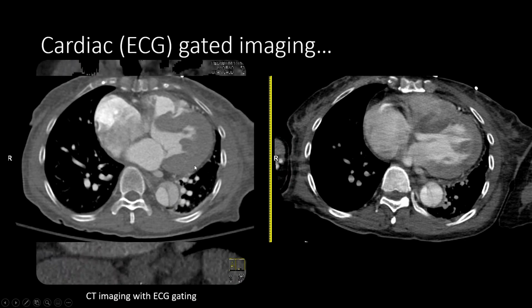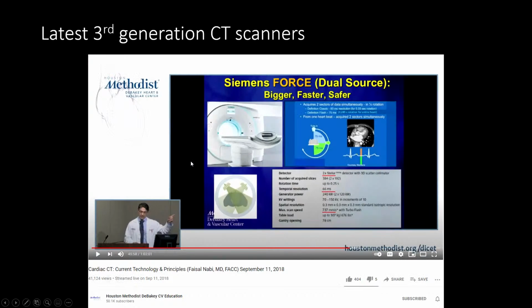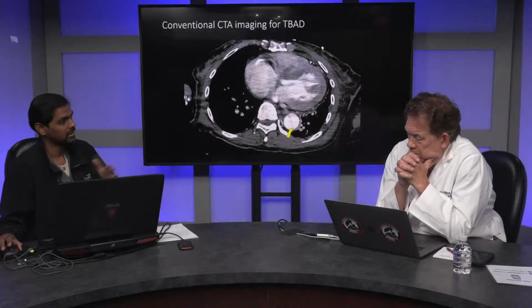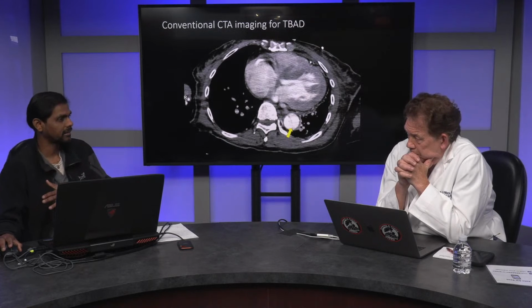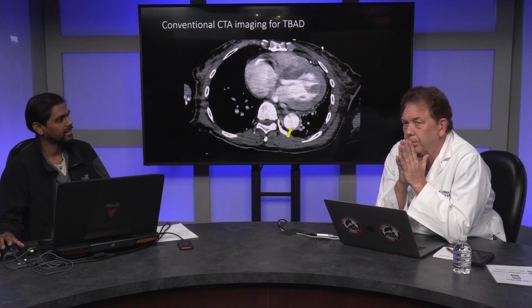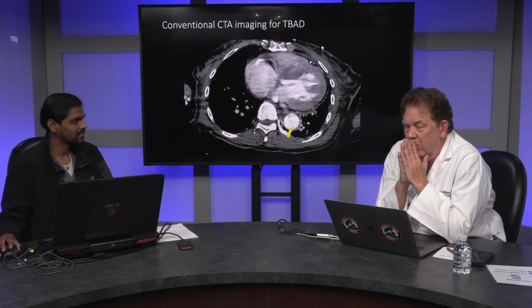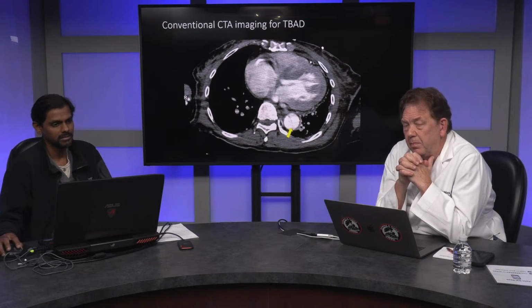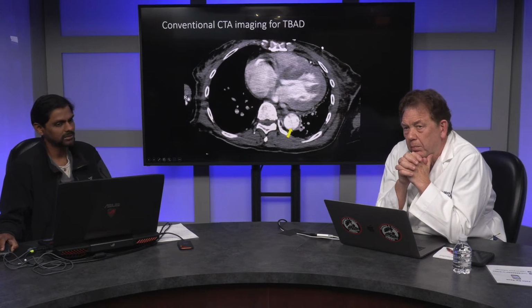This is the case I'm making for how we can get from conventional CT to gated CT, especially in a patient with a dynamic disease process. It's probably okay for aneurysmal disease, especially if the aneurysm is in the descending thoracic aorta or the infrarenal aorta. There is not a lot of cardiac movement. Not a lot, I say. There is a little bit, especially when we are thinking about evaluating endoleaks and such. But this is the reason why we wanted to go to the next step.